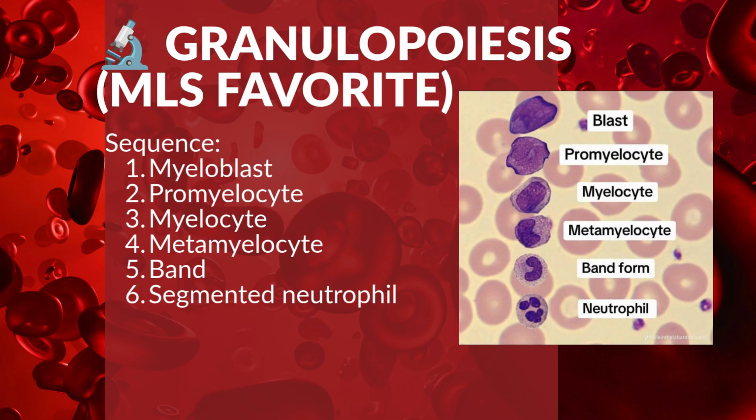Promyelocyte. The promyelocyte is slightly more mature, but not enough. The primary granules appear a little bit. The granules are light and dark. The nucleus is still immature with visible nucleoli. You see that dang eyeball right there. Even if it looks like it ain't connected, you see how the cytoplasm is trying to disconnect. It still don't look like it's supposed to be outside.